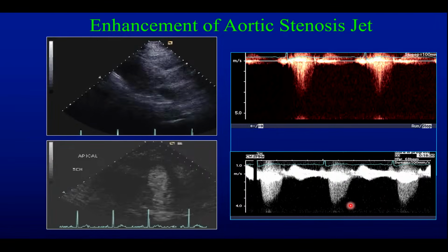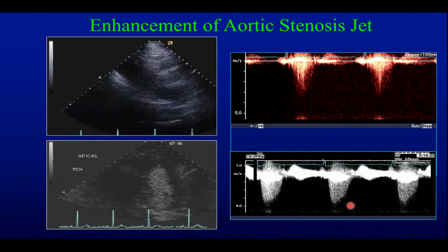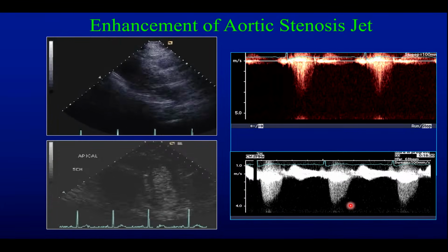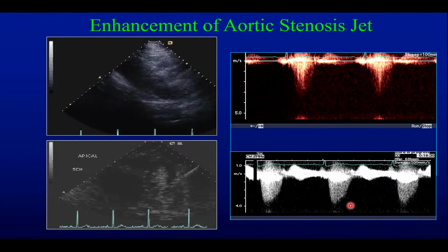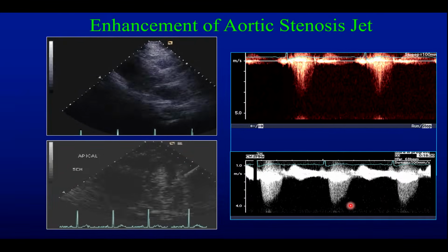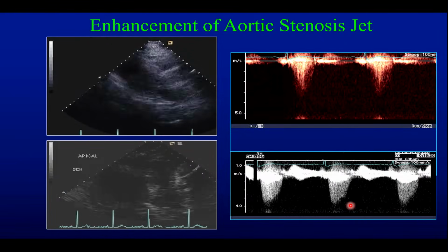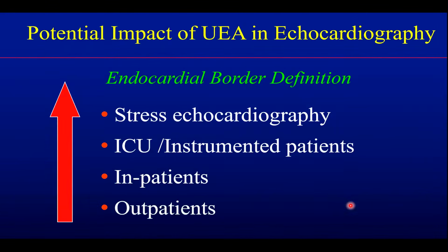bit, right? So after you inject the contrast, just wait for it to diffuse a bit so you have less concentration and less over blooming of this situation. Same thing with TR jets. Again, early on, wait for it to come down a little bit so that you don't overestimate the situation.